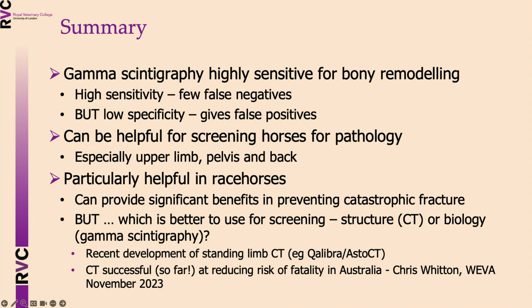So to conclude, scintigraphy is highly sensitive to bone remodeling, so has very high sensitivity with very few false negatives. But it has low specificity, which means there are many false positives. But nevertheless, it is very helpful for screening horses for pathology, especially in the upper limb, pelvis and back, and especially in race horses.